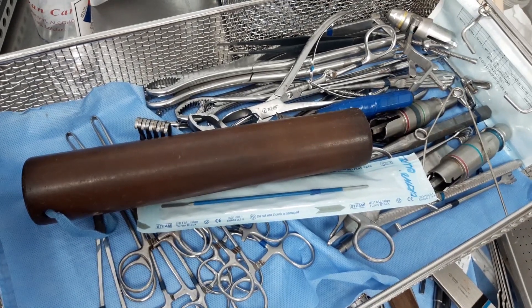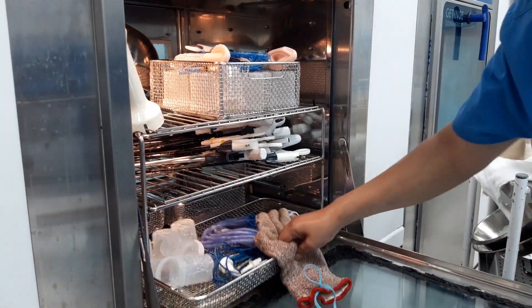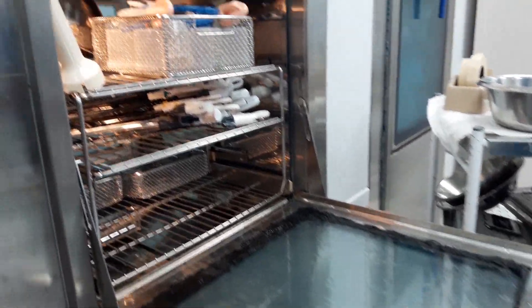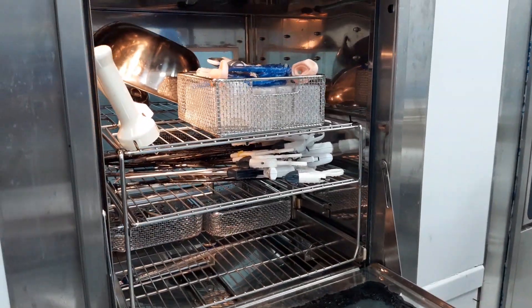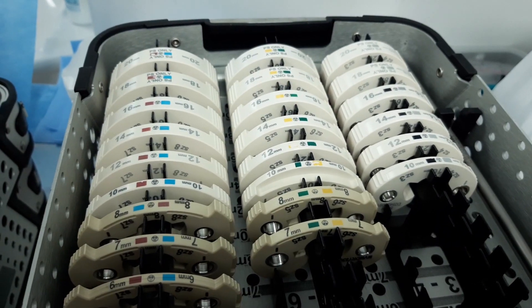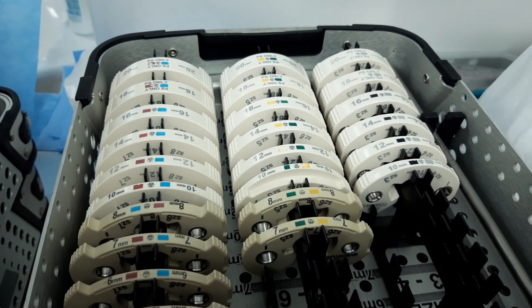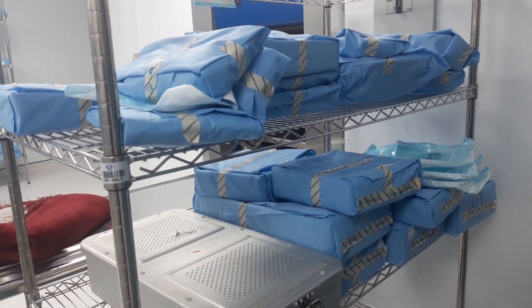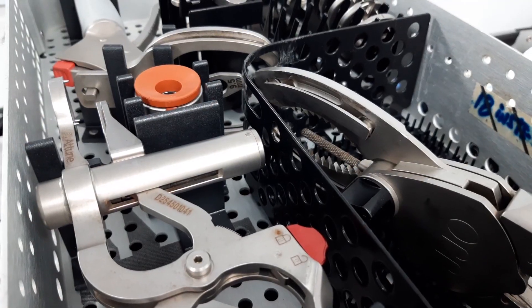The automated metering of the liquid process agents — consisting of cleaning agents, neutralizers, and rinse aid — optimizes the cleaning and drying outcome. The instrument disinfection is, however, accomplished by hot water over a prescribed period.